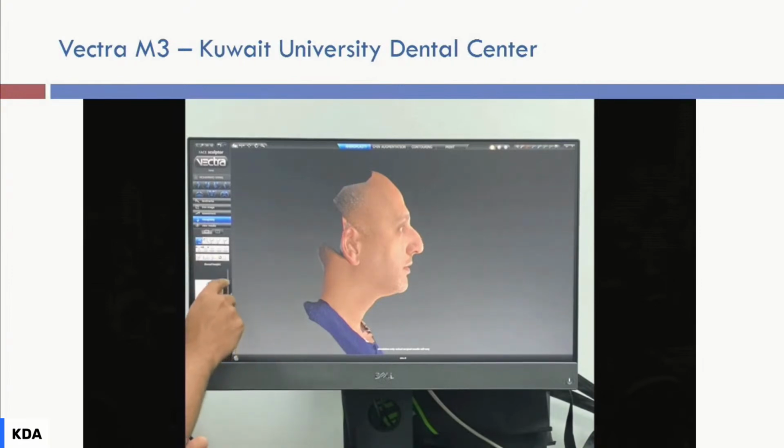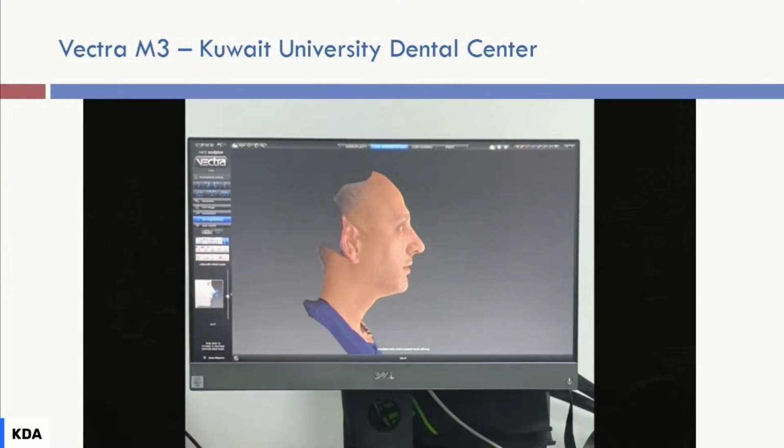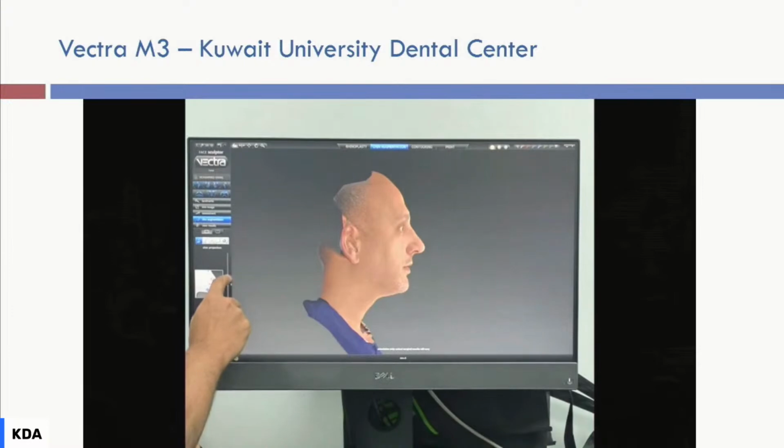Then you can go, look here at treatment simulation. I don't know, look at my nose. I'm trying to manipulate the nose for rhinoplasty. Projection, under projection. Based on the AI that we have, you can play around with the points and predict your surgery. Let's go now, probably I'm going to the chin. So at the chin, frontal view, you're not going to see much, so I'm going to flip back to profile view, and I'm going to do genioplasty, projecting the chin, enlarging, reducing, up and down.